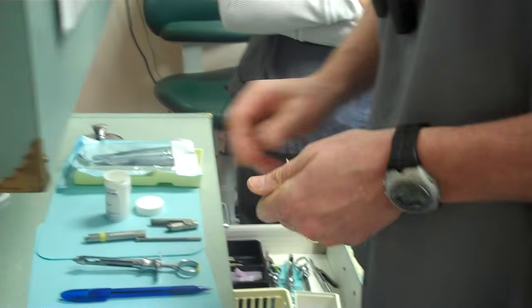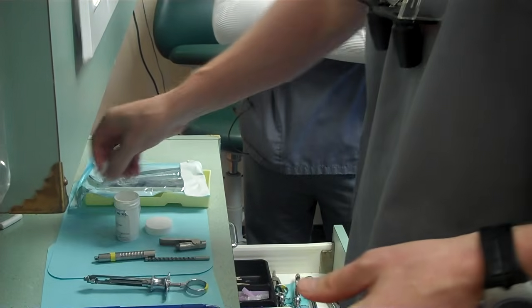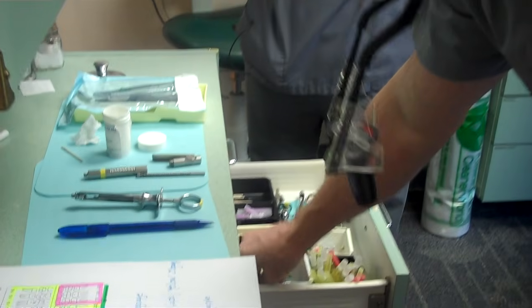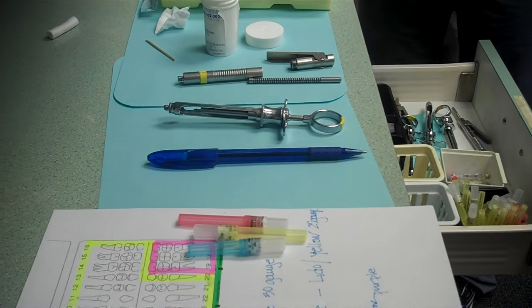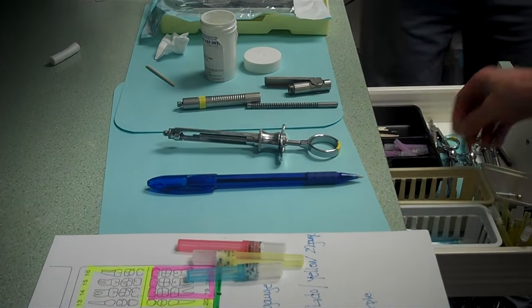All right. Sometimes it's confusing, the different types of needles we use and the different types of anesthetics we use. So I'm going to try to make this as simple as I possibly can and talk about the different anesthetics in the practice and why they're used. So let's look in the drawer here, and we're going to pull out the different ones. This one with the red stripe, that's lidocaine.